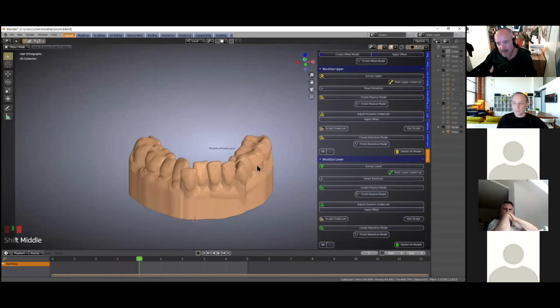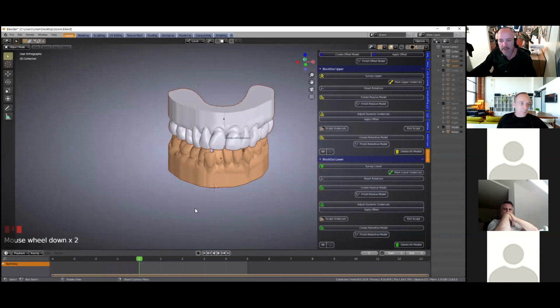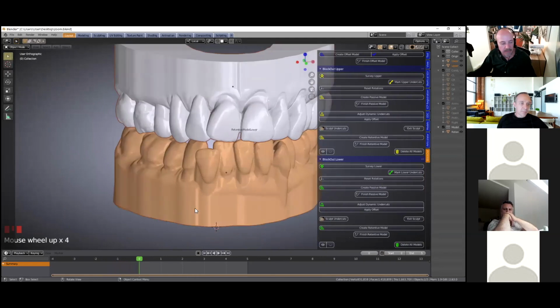Okay. So are there any questions regarding this now? I hear someone talking. Yeah, no, not sure. No, I think we're all good there, Michael. So you just keep the one model and get rid of the others to free up space. You don't want Blender to slow down.